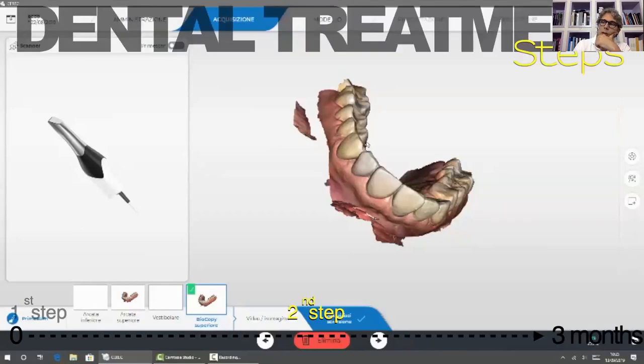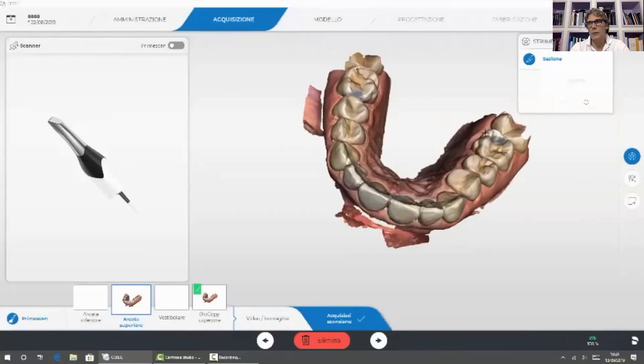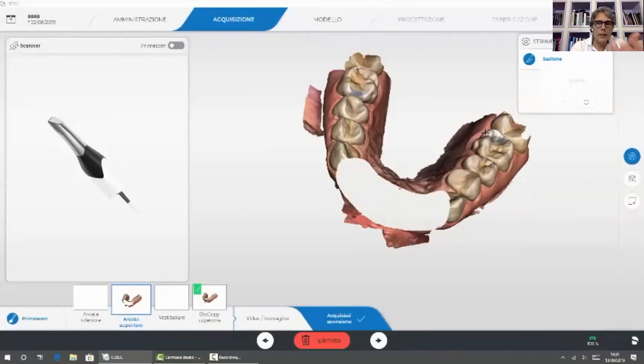So in a subsequent step, I activated the digital cutter, with which I cut the anterior four upper incisors from the upper master model, because in the next step, after the preparation step, I can take the last impression, rebuilding this master model and filling completely this space previously created by the digital cutter with the new morphology of the prepared teeth. And the software will be able to recognize the teeth not involved in the preparation step, and it will be able to match the two master models perfectly. That is one of the amazing features of this amazing software, 5.1.